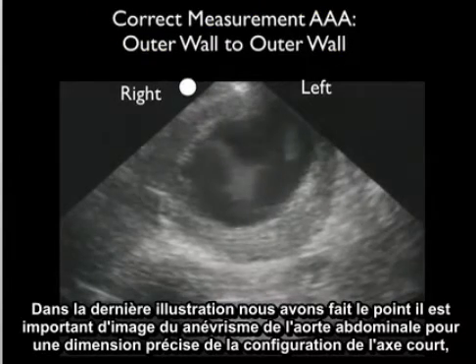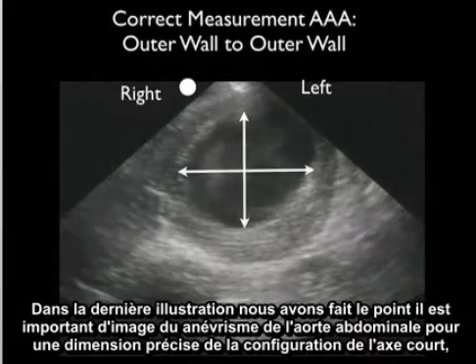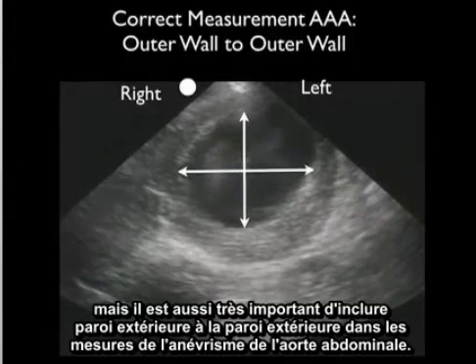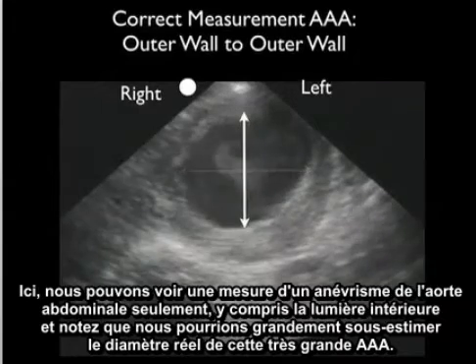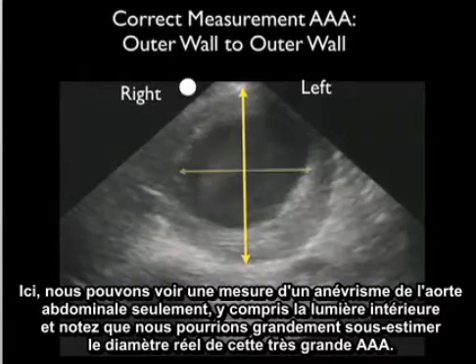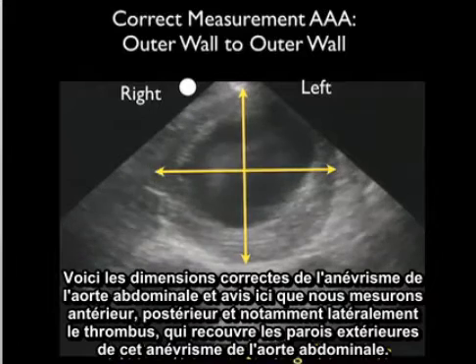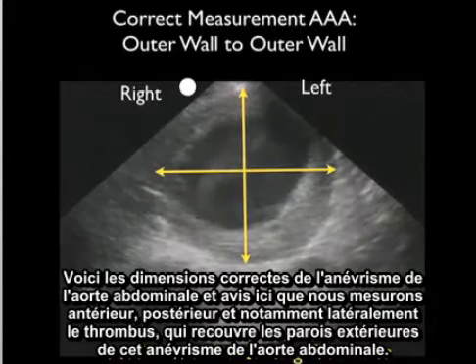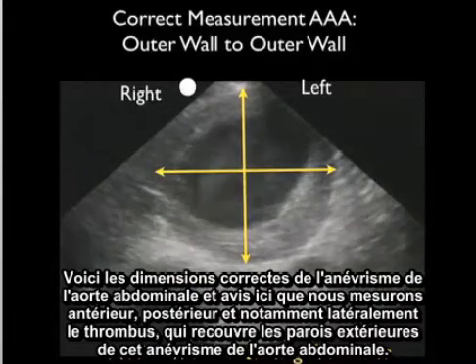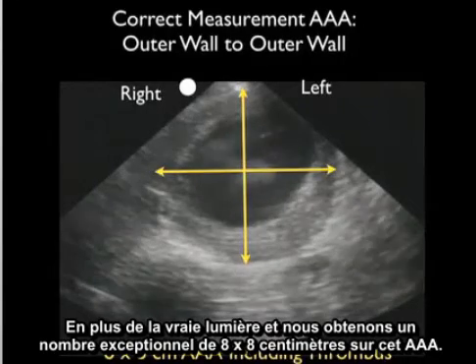It's important to image the abdominal aortic aneurysm for an accurate dimension in the short axis configuration, but it's also very important to include outer wall to outer wall in the measurements. Here we can see a measurement of a triple A only including the inner lumen, and notice that we could vastly underestimate the true diameter. The correct dimensions include measuring anterior, posterior, and laterally, including the thrombus that coats the outer walls, in addition to the true lumen, and we get a measurement of 8 by 8 centimeters on this triple A.